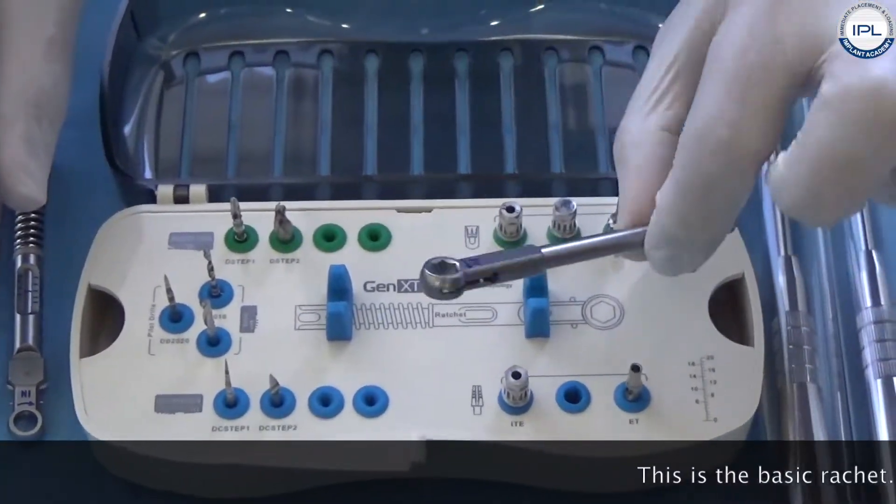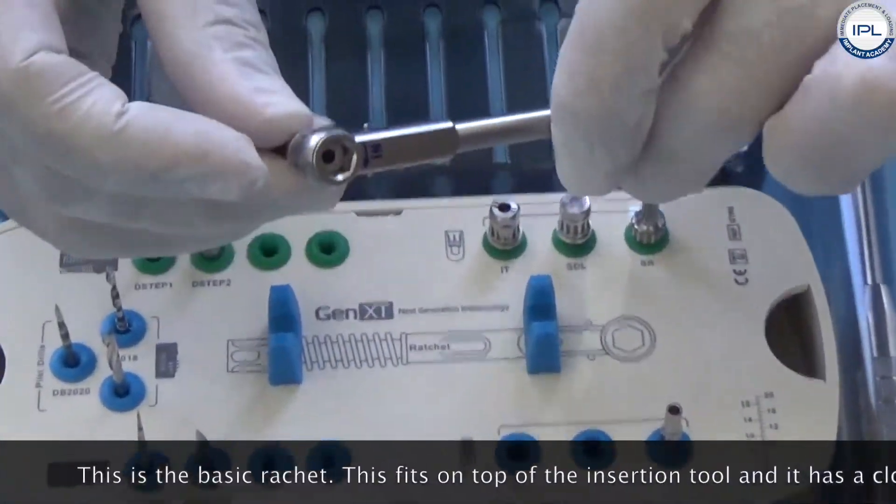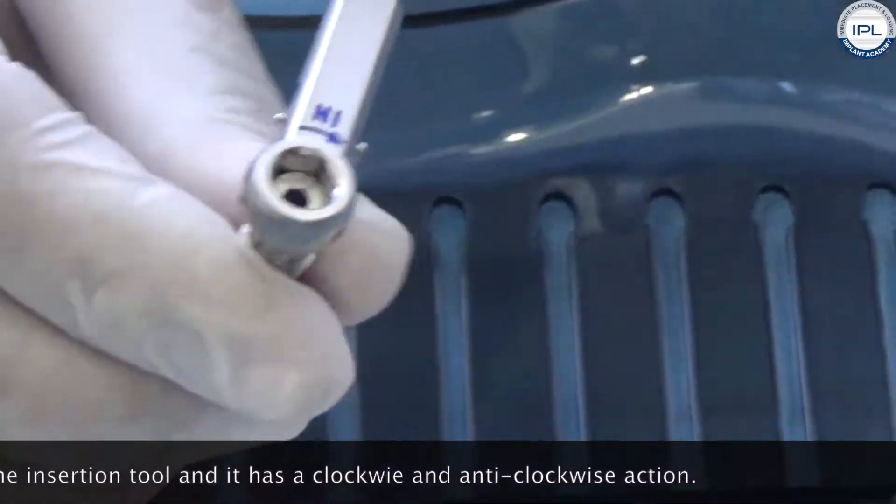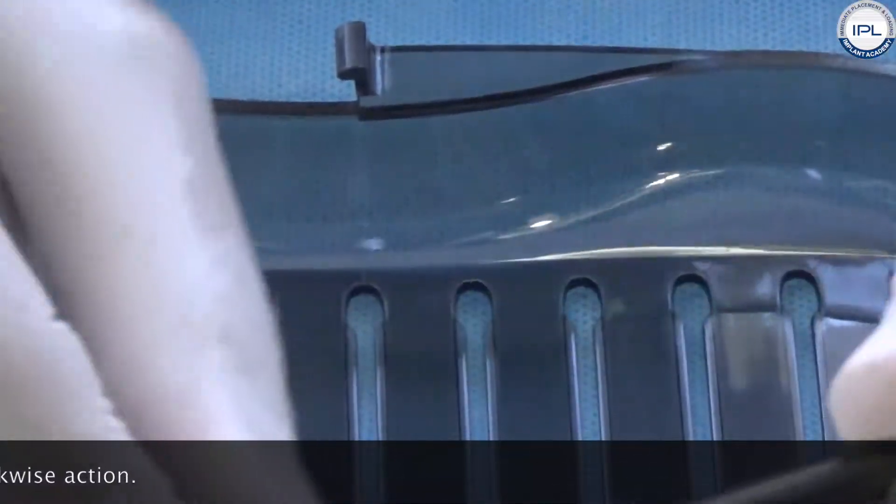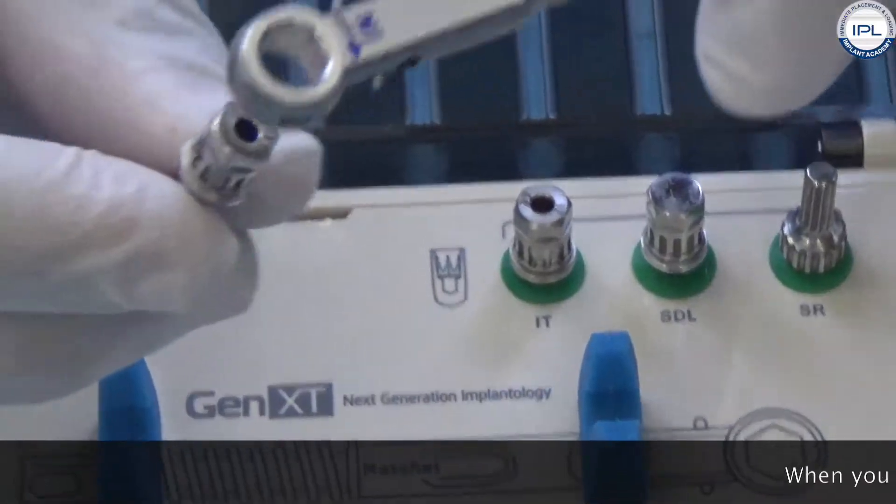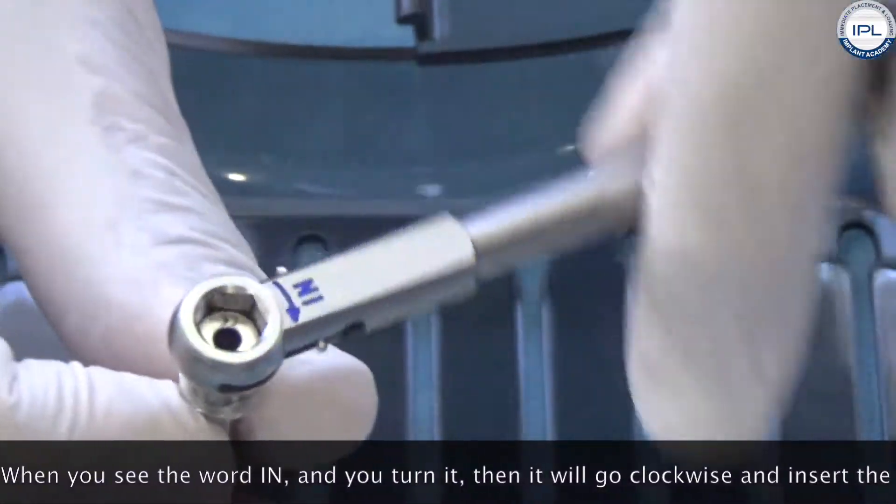Then this is the ratchet. This is the basic ratchet and this fits on top of the insertion tool. It has a clockwise and an anti-clockwise action. So you must see the word in. When you see the word in, when you turn it, it will go clockwise and it will insert your implant.